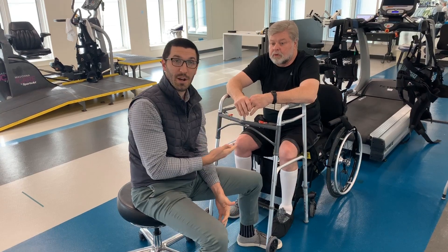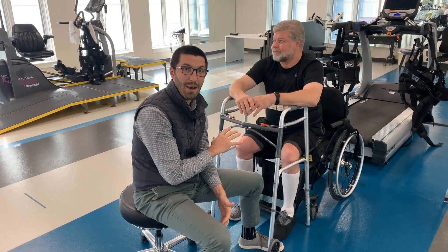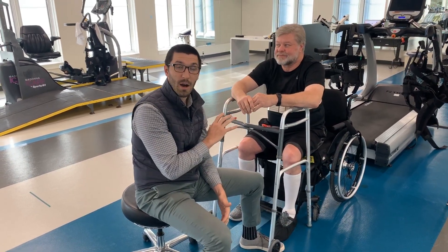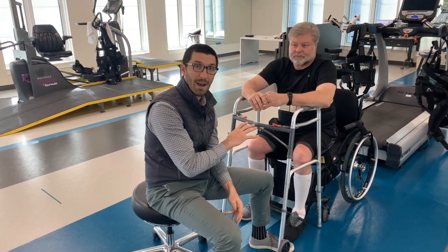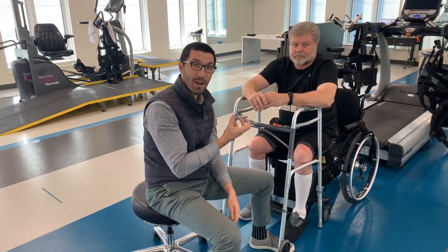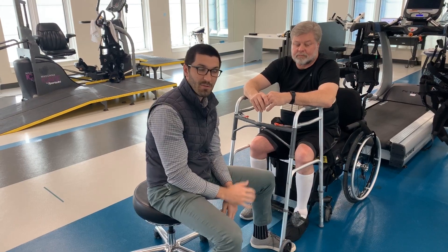So we've been doing a lot more gait training, and what I want to do today is just demonstrate the value of having a body weight support system. Specifically, we'll be using the Zero-G body weight support system today. First I'll show you how John stands and even takes some steps without that body weight, and we'll compare it to the body weight after that. So let's go ahead and get started.